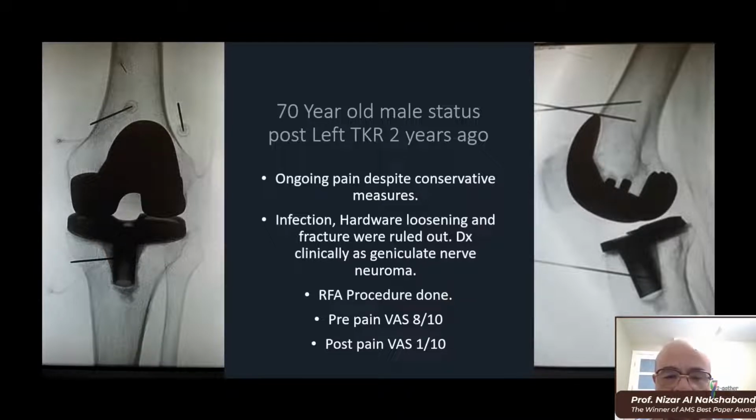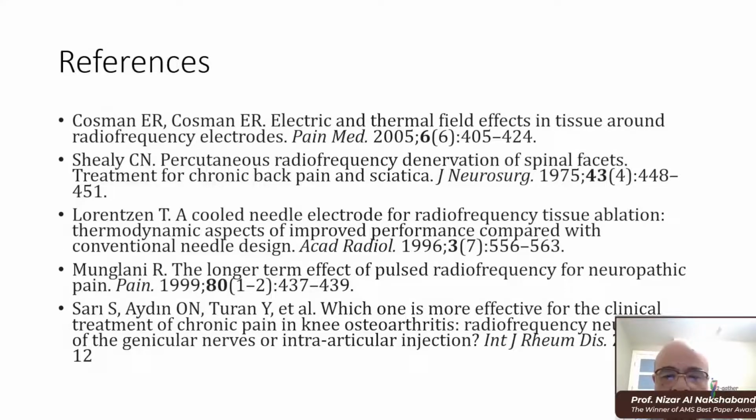He had the radiofrequency ablation, and the pain score at baseline was 8 out of 10, and at 12 weeks was 1 out of 10. So this is my short talk about radiofrequency ablation. I think this is a procedure that should be implemented by most musculoskeletal interventional radiologists.